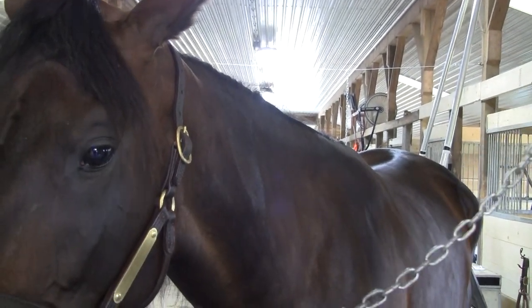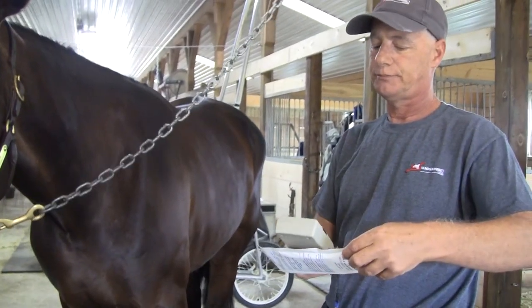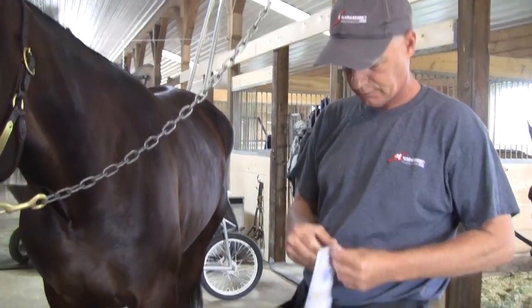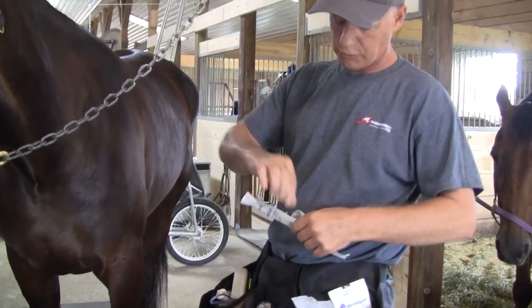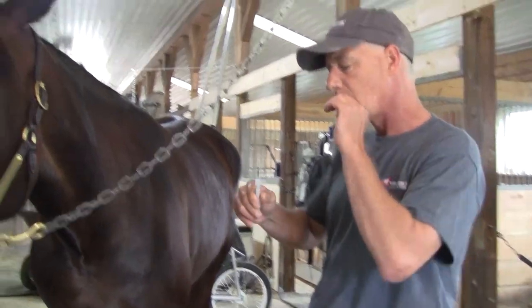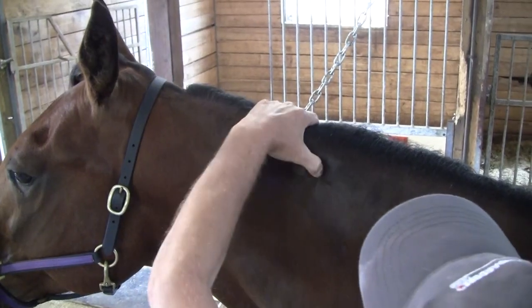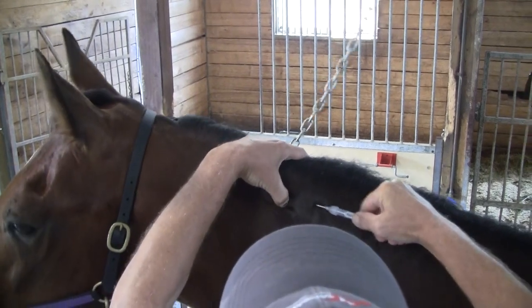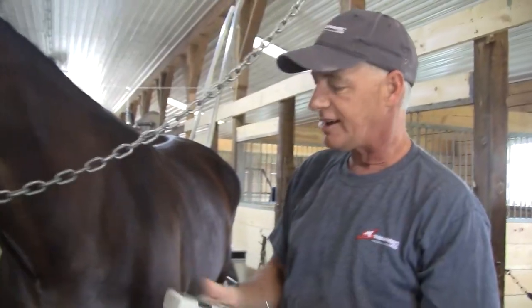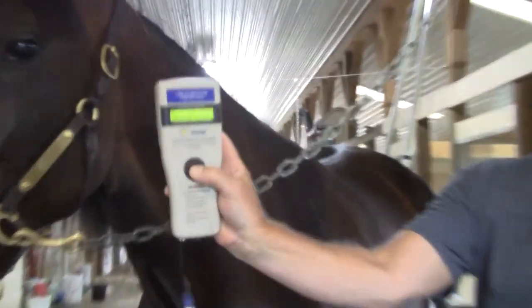Now we're going to take the chip. We're going to verify that the chip is the correct number that it says on the card — just to make sure: four, two, six. Remove the chip from its package, remove the guard, prepare to insert the chip. And that's it. Now I'm going to scan the chip to make sure it's reading. And it is. And there's the horse's new ID.